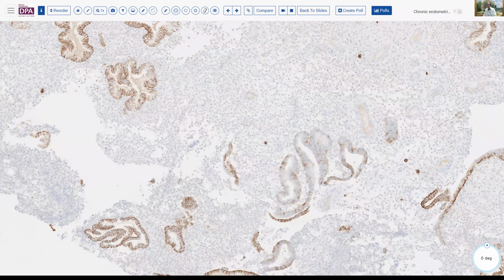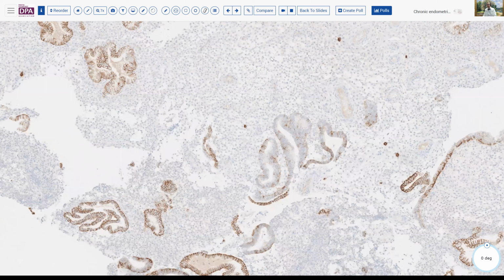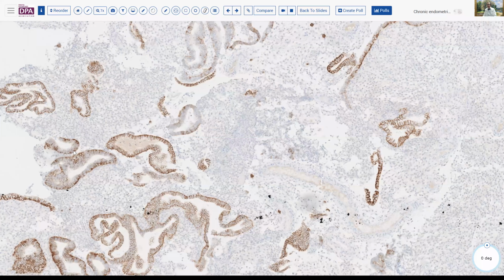possible or suggestive of, but I would not be flat-footed: this is absolutely surely chronic endometritis. I would say more likely suggestive of, because in this situation, we've had a hormonal cycle, and it would be relatively uncommon to have the active plasmacytic inflammation in the endometrium.